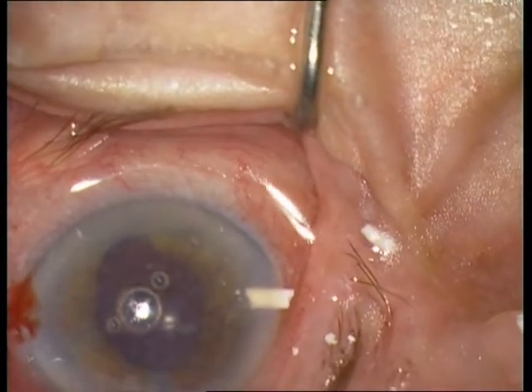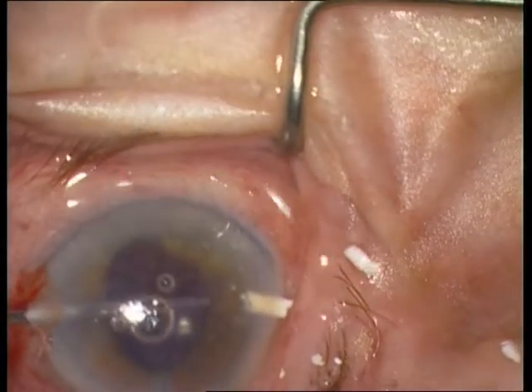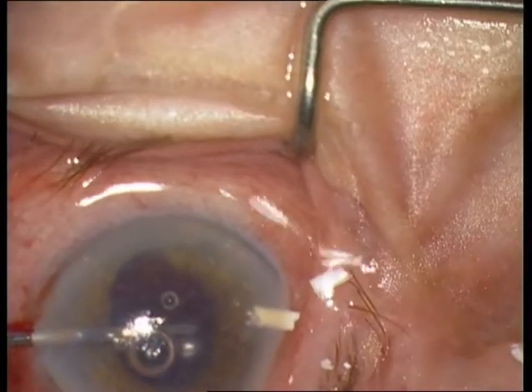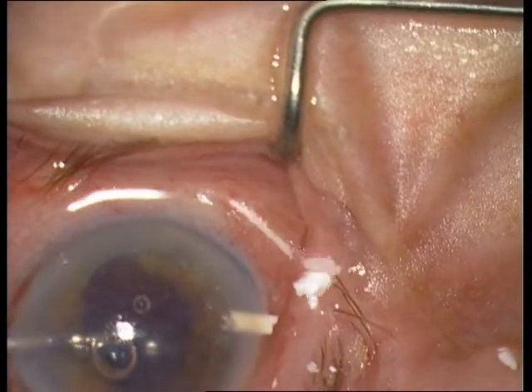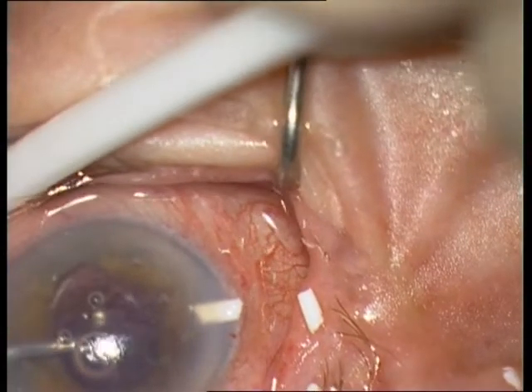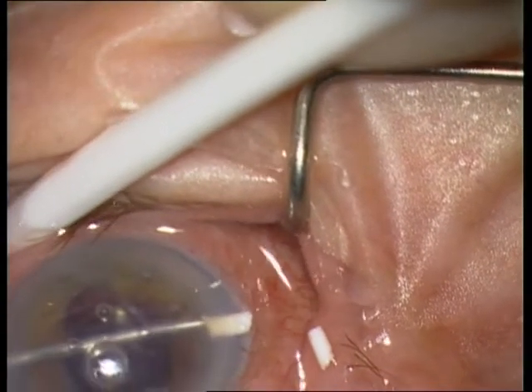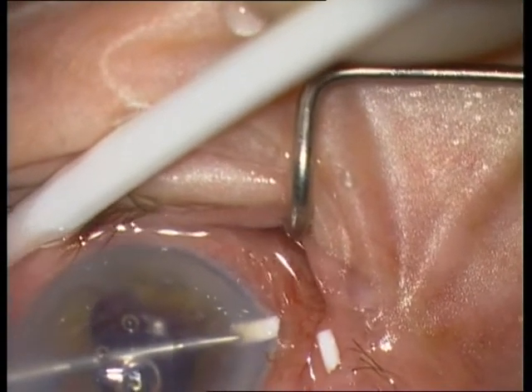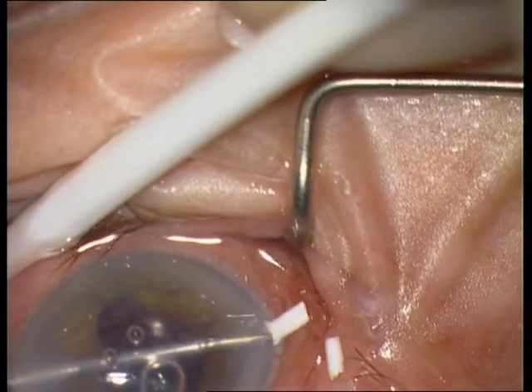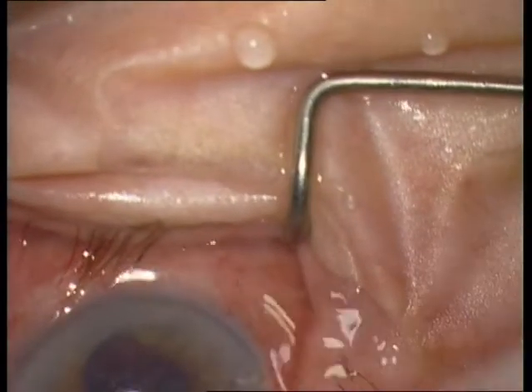I am pulling and pushing the implant through the paracentesis at 9 o'clock. Now I am again pushing the implant with the intravitreal scissors from 3 o'clock. And now the implant is completely removed from the anterior chamber.